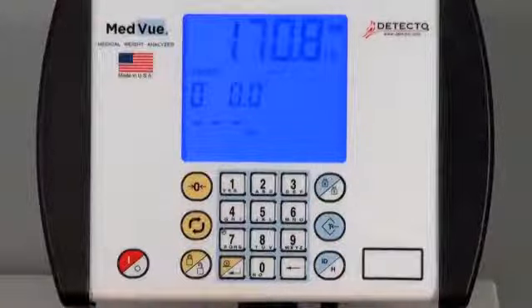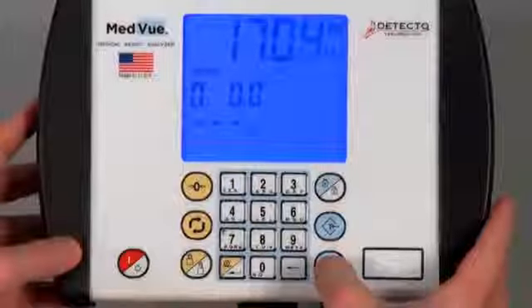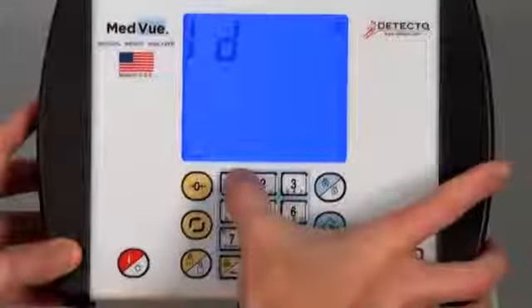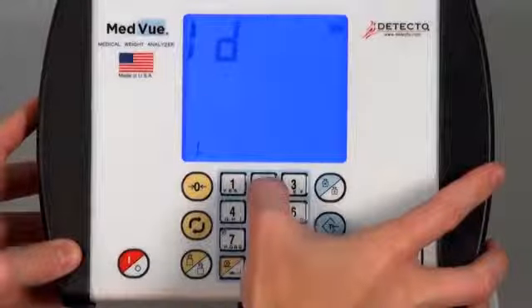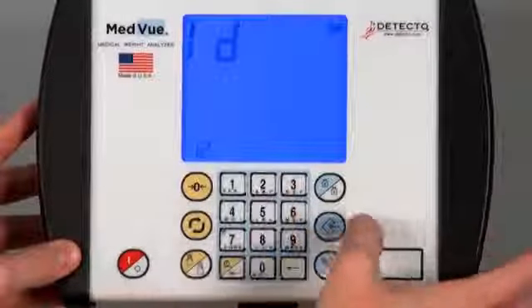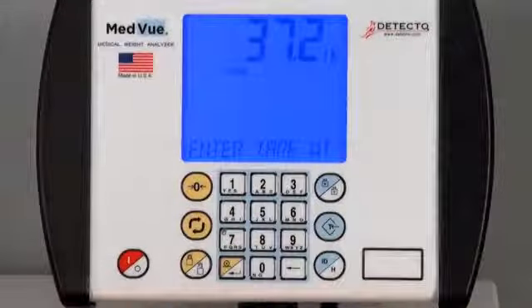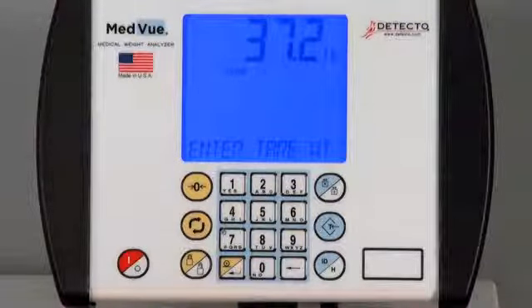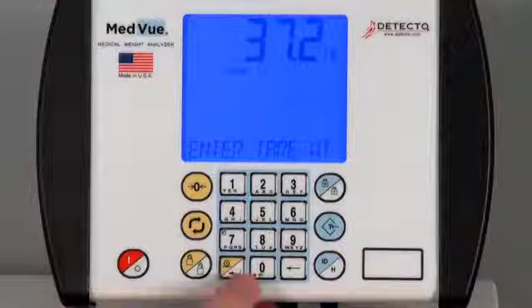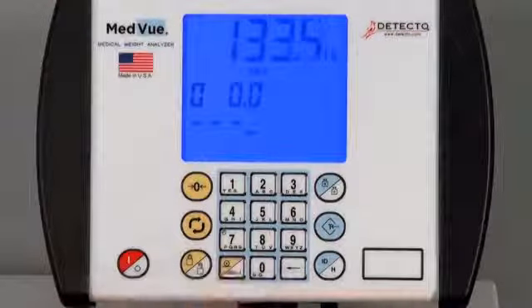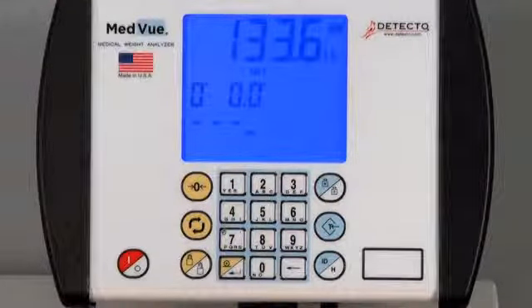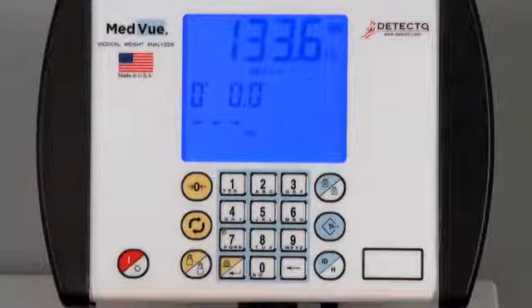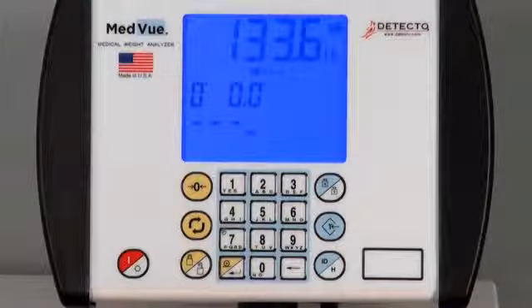To recall stored tare weights, from the Net Weight mode, press the ID Height key and enter the desired memory location number, then press the Tare key. The display will change to Enter Tare Weight and the stored tare weight will be shown. If the weight is acceptable, press the Enter key again. The scale is now adjusted for the tare weight and you will be able to accurately view the patient's weight.